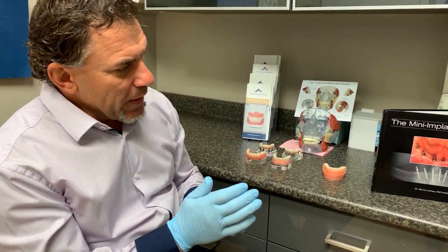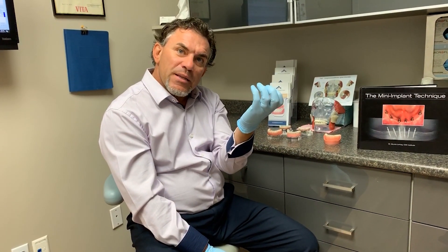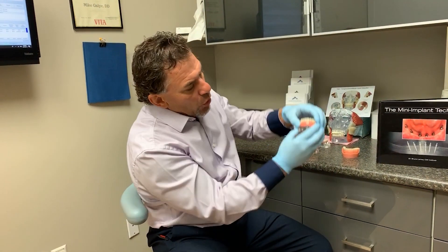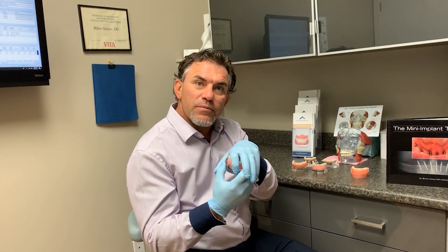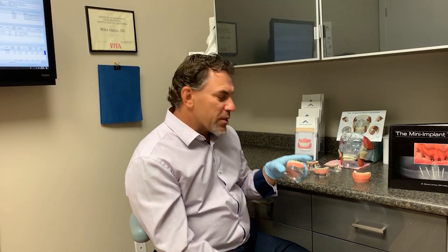With mini implants, it's always going to be a denture that anchors to the implants. There's a common belief that the implant supports the denture — it doesn't. The dentures have to sit flush to the gums. The attachments inside the denture are strictly there to hold the denture against the tissue. If the patient's jaw is moving, the dentures are tracking the movement of the jaw.